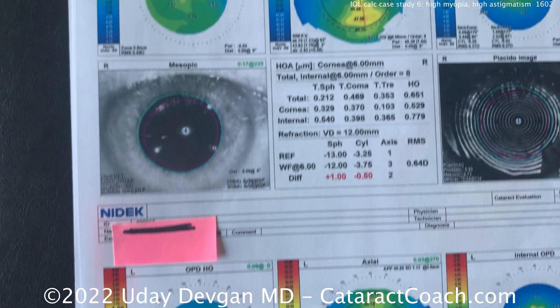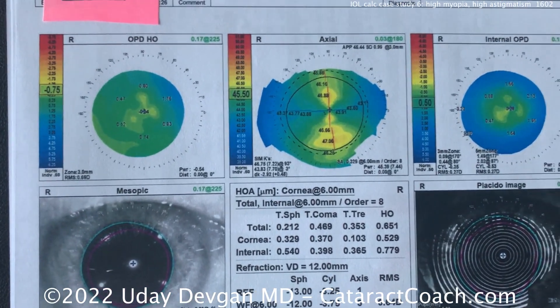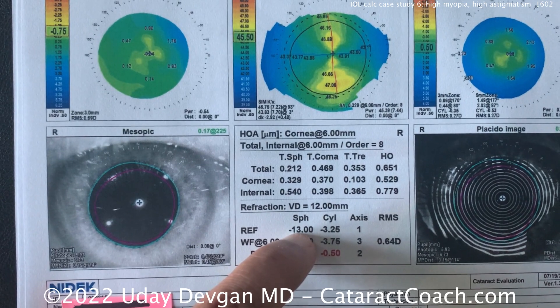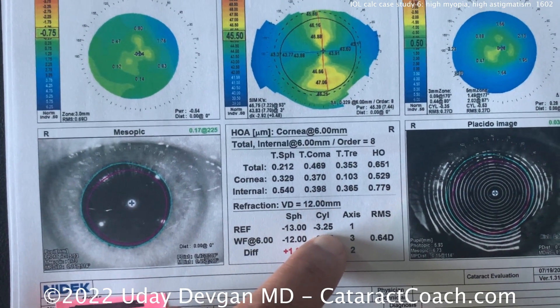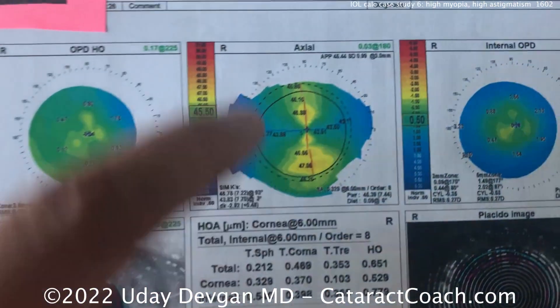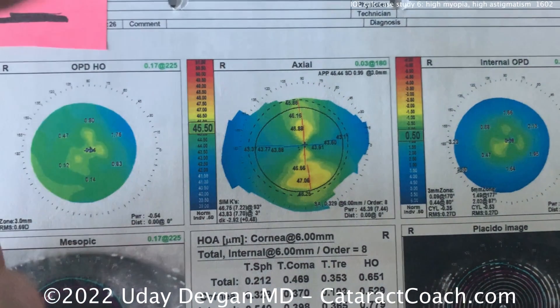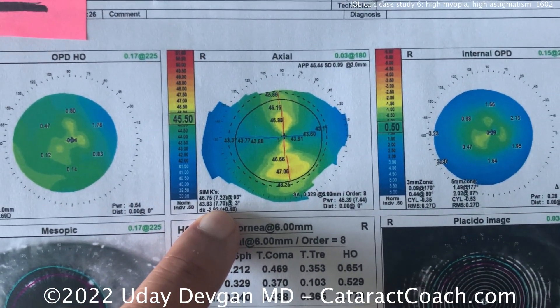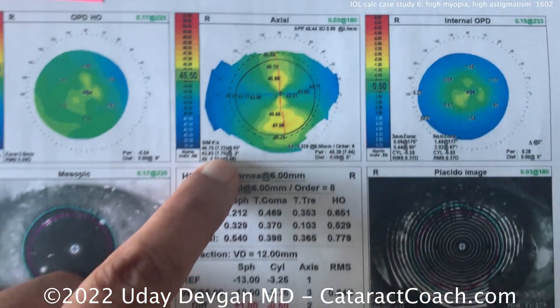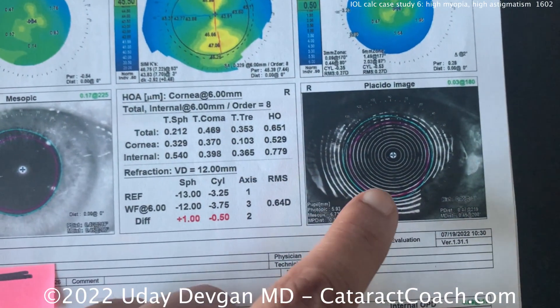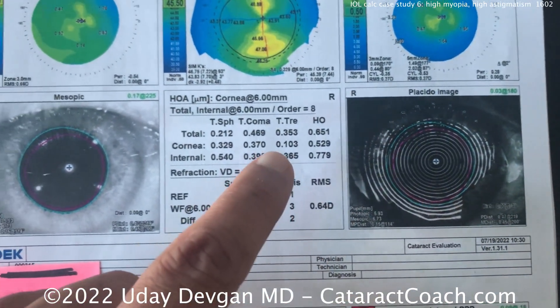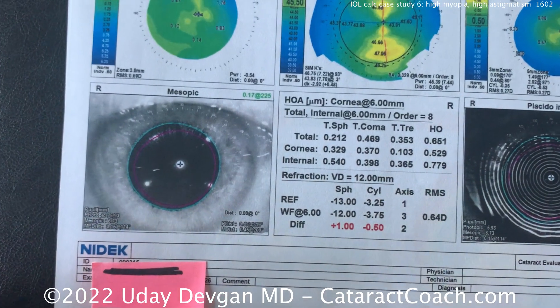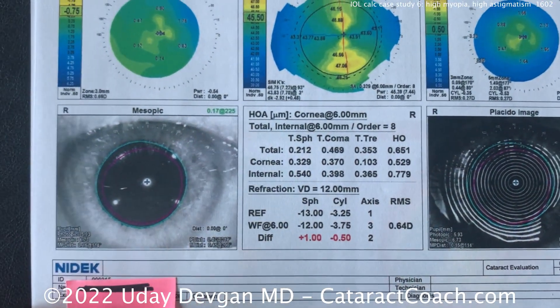Let's look at this eye here. The right eye is up on top. The patient has a refraction somewhere in the minus 13 range for spherical and about 3 diopters of astigmatism. On the topography, there's a bow tie with-the-rule pattern, again about 3 diopters of astigmatism. Topography looks reasonable. There are higher aberrations and a large pupil size — he already had dilation drops in, so don't hold that against him.